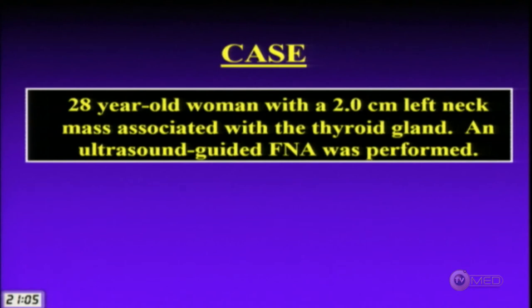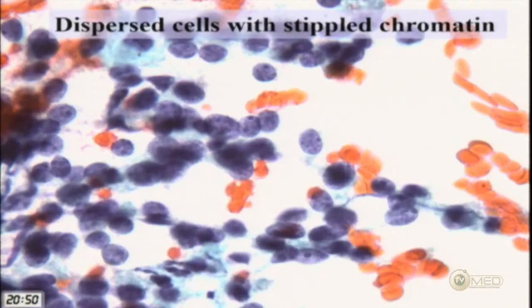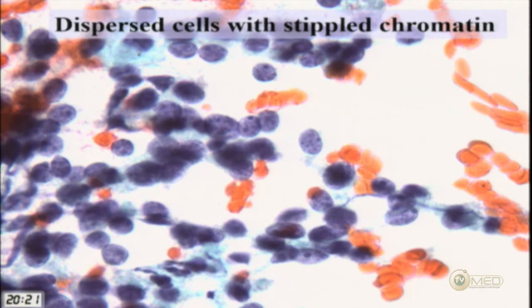The third case is a 28-year-old woman with a 2-centimeter left neck mass associated with the thyroid gland; an ultrasound-guided FNA was performed. The FNA shows dispersed cells, loosely cohesive but mostly single-cell-like pattern. One notable feature is a stippled chromatin pattern — also called salt-and-pepper chromatin — giving a neuroendocrine look.